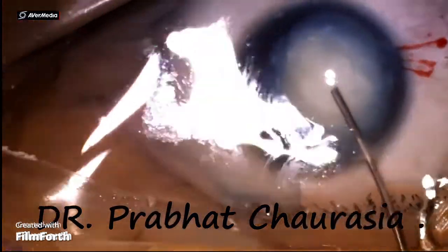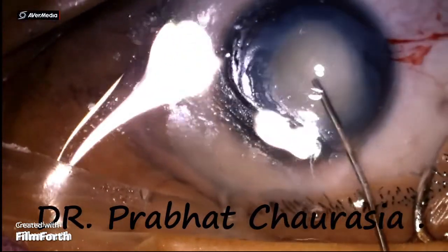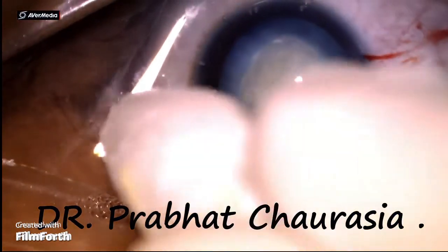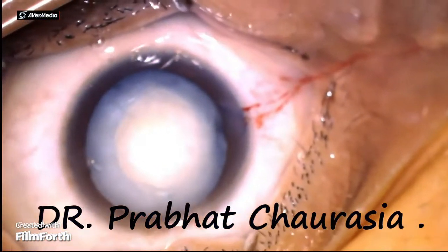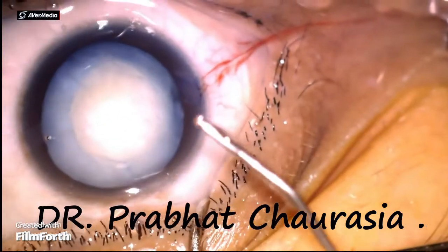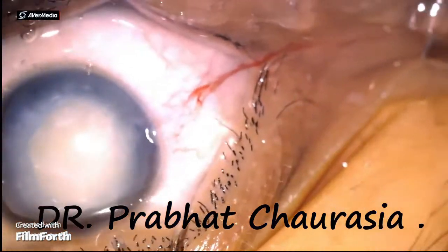While doing the hydro procedures, the paltaceous material or liquefied cortex came out. Now inject HPMC again.